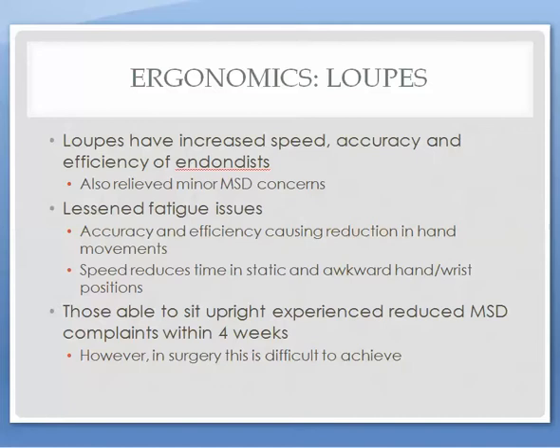Loupes are devices attached to the glasses that increase magnification of the surgical area that have resulted in the benefits of increased speed, accuracy, and efficiency. However, they did little to alleviate most MSD concerns. However, some fatigue issues were resolved, such as reducing hand movements from being more precise and accurate, as well as a reduction in time in awkward positions.